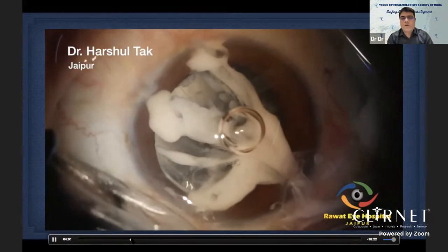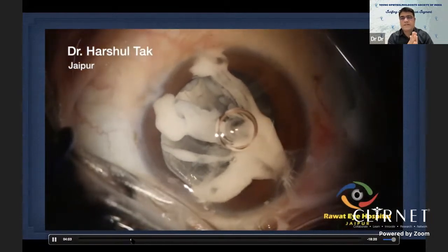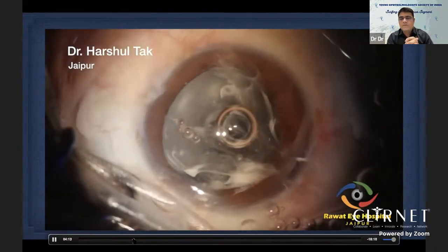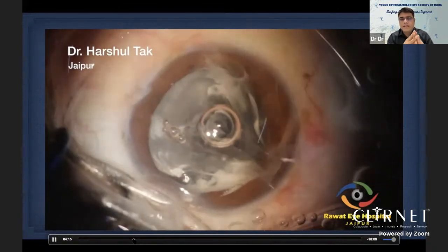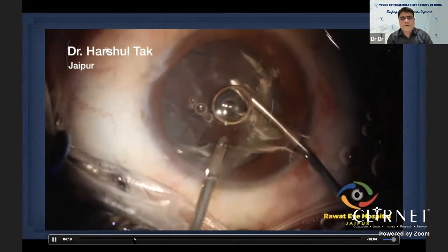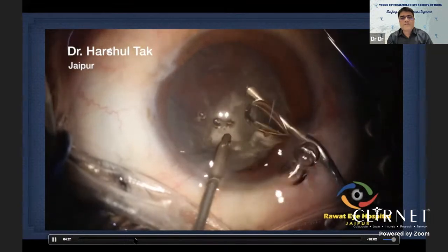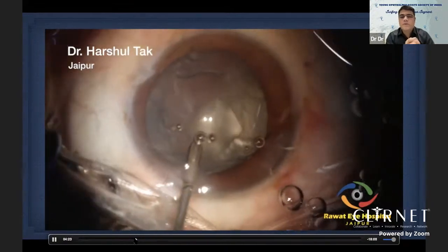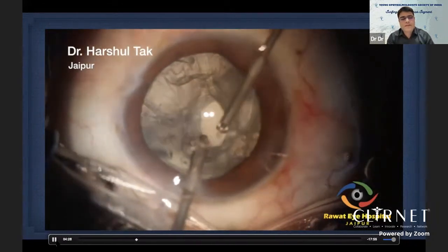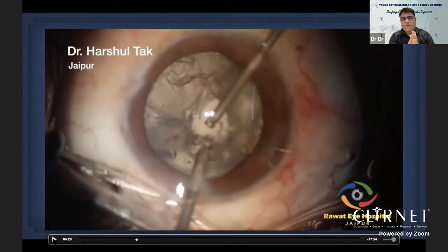So here you need to put triamcinolone to stain the vitreous and visualize it. You can use either the same concentration or you can dilute it to 1:4. Once you have taken off the excess triamcinolone, you need to do bimanual anterior vitrectomy. The aim of vitrectomy here is to cut the vitreous. At this stage, there's a lot of vitreous there.